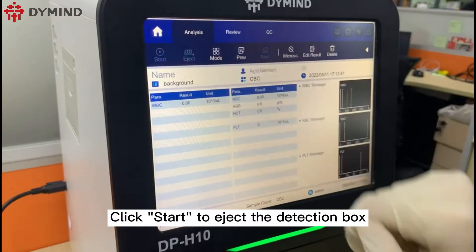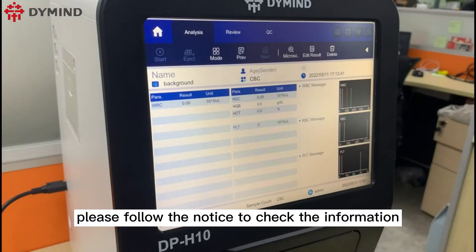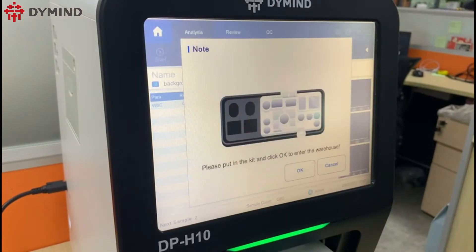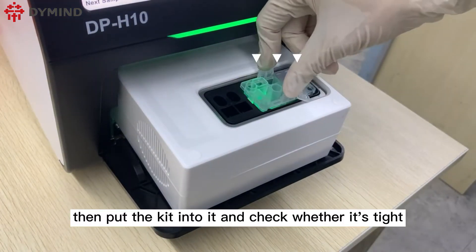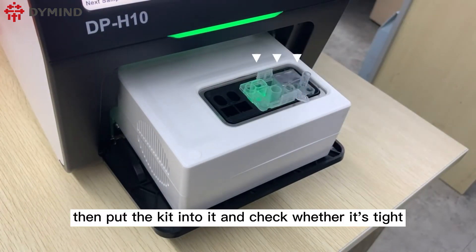Click start to eject the detection box. Please follow the on-screen notice to check the information, then put the kit into it and check whether it is tight.